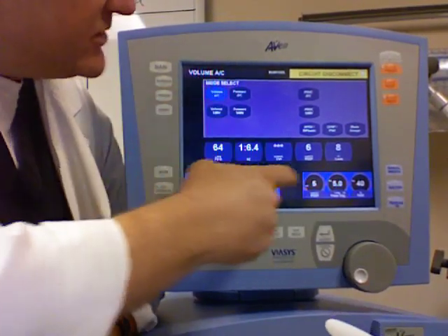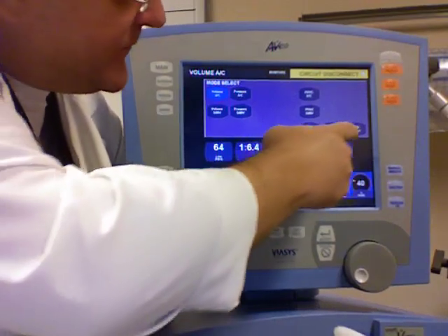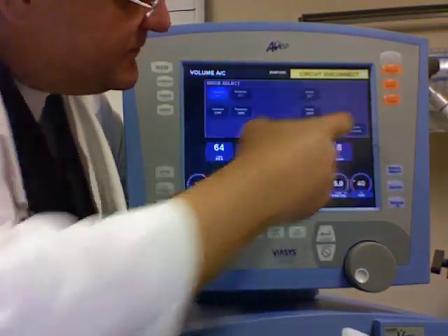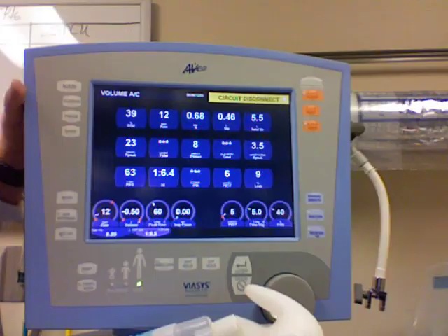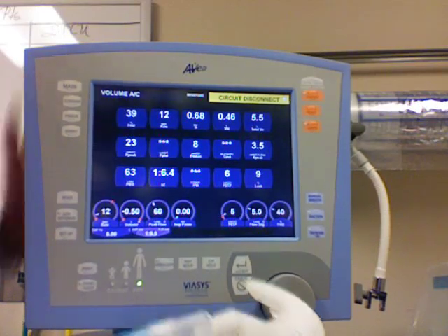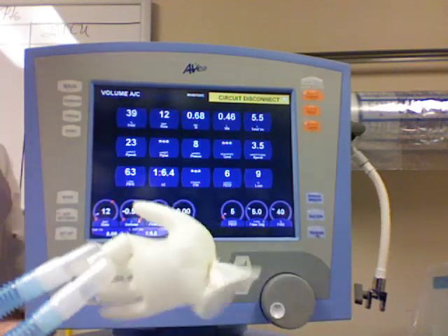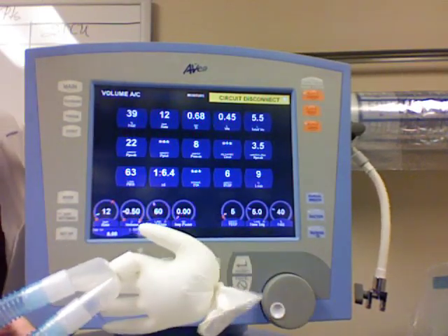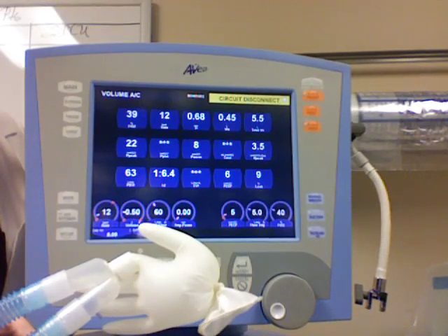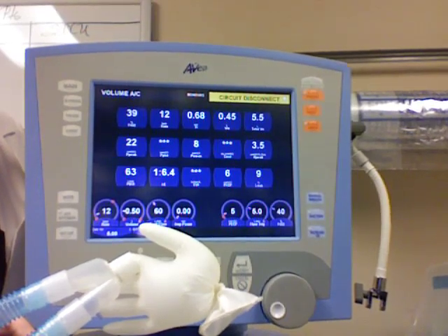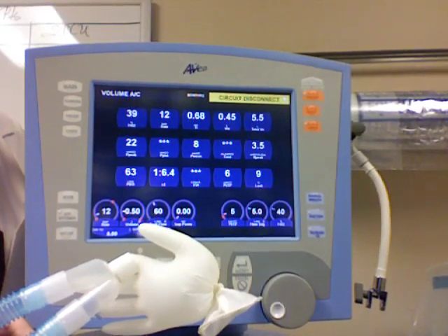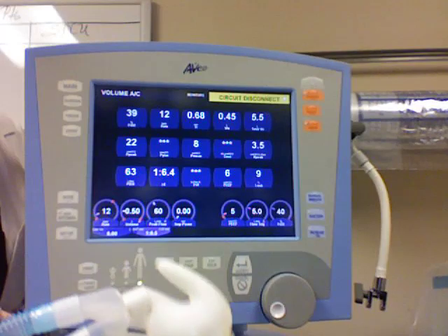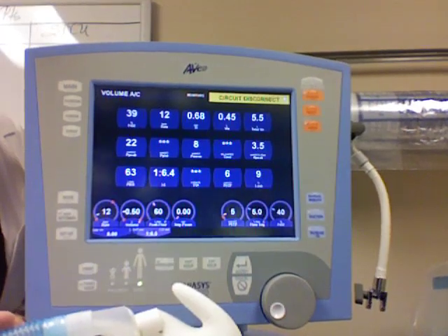I'm going to leave it on volume ventilation right now. Now that you know type — ventilator breaths are two types, volume and pressure, and I'm using volume right now — let's talk about modes.